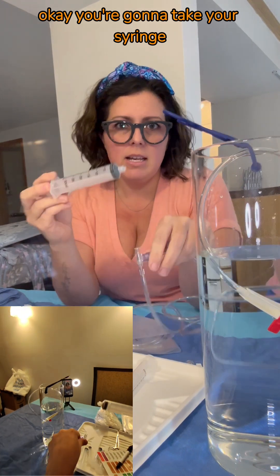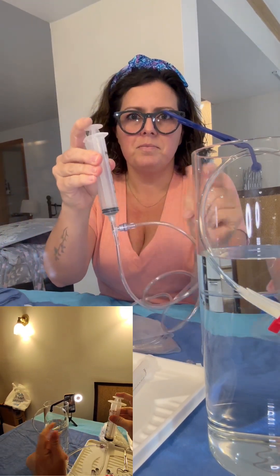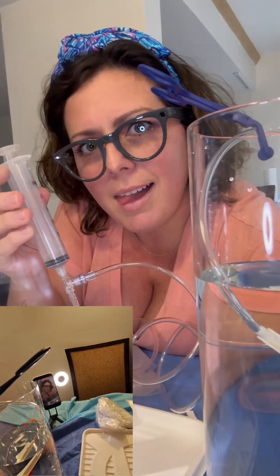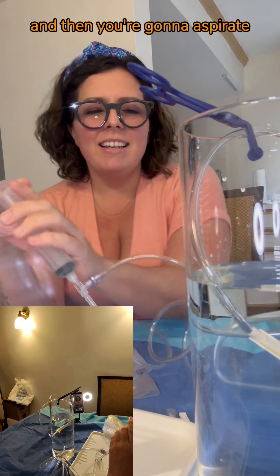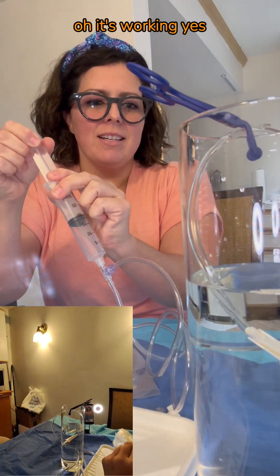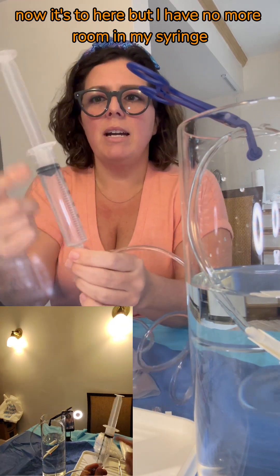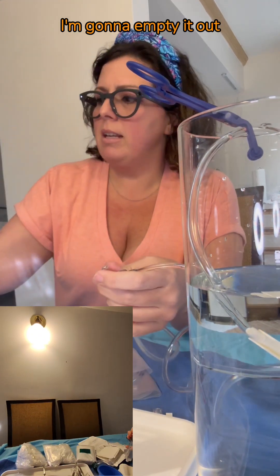You're going to take your syringe and connect it to the one-way valve. And then you're going to aspirate — fancy for drawback. It's working. So I'm clearing all the fluid through the line. Now it's to here, but I have no more room in my syringe. I'm going to empty it out.